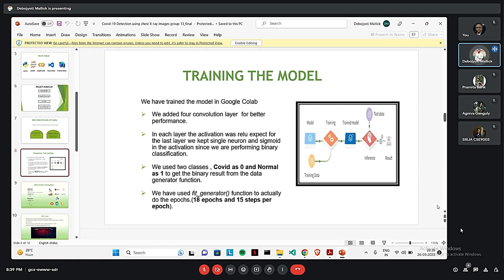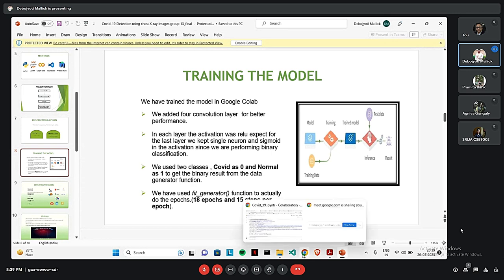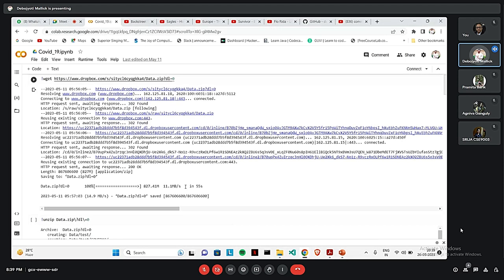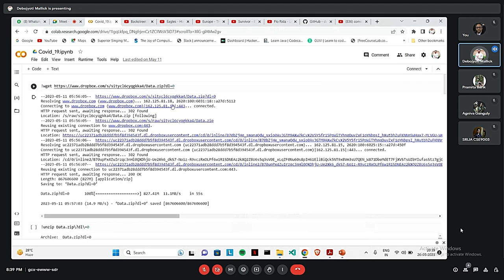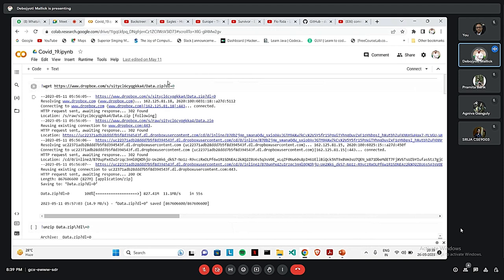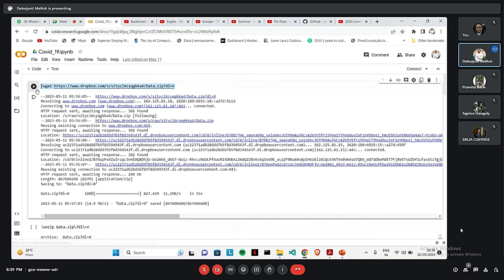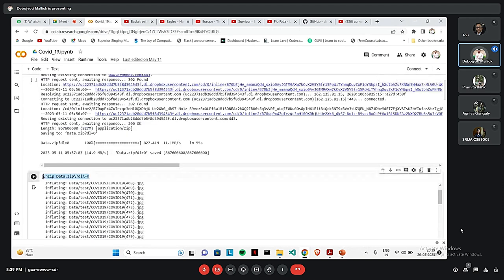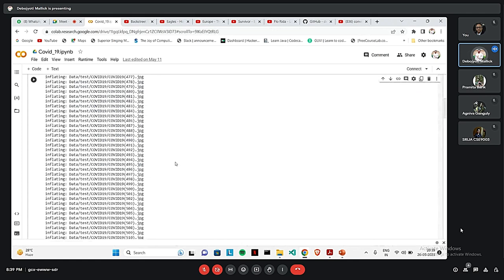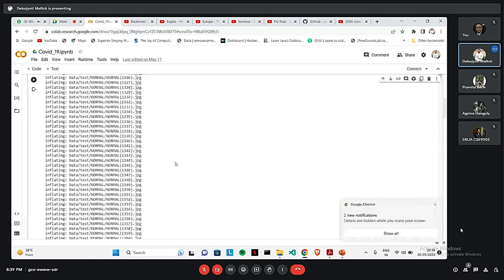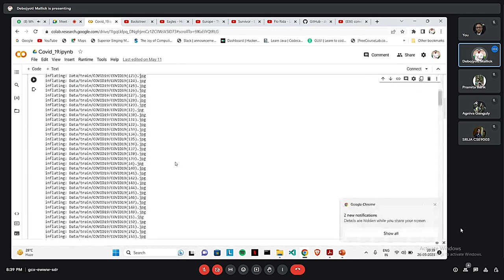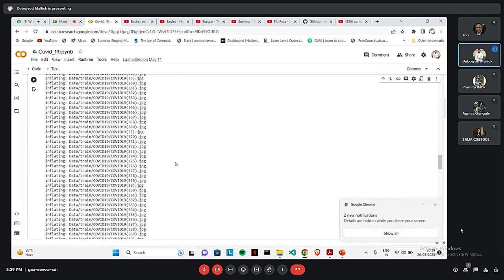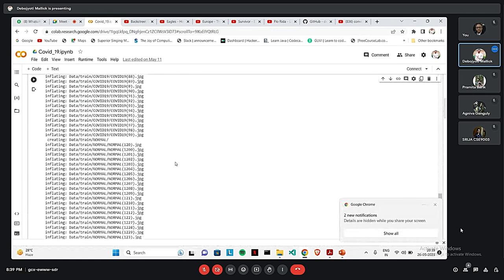The two classes that we have are COVID as 0 and normal as 1 to get the binary result. We have used fit generator function to actually do the epochs. For our training model, we have used 18 epochs and we have 15 steps per epoch. Here we have uploaded the dataset in Dropbox and in this line, we have imported it from Dropbox to our Google Colab. In this line, we have unzipped the folder.